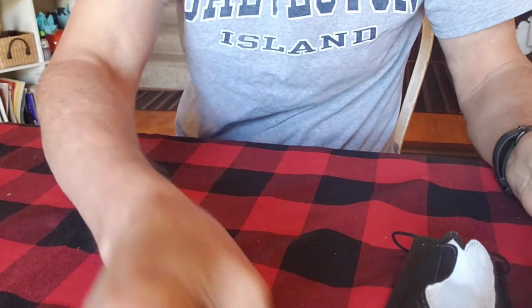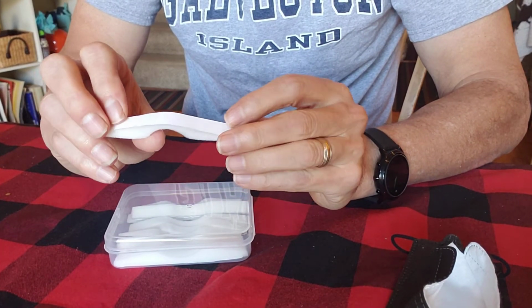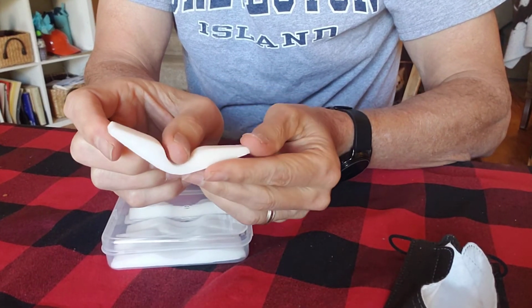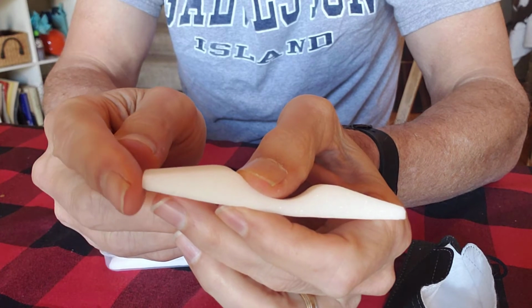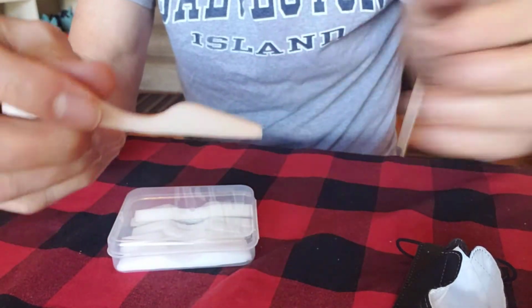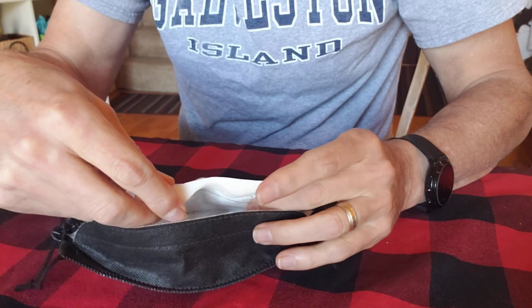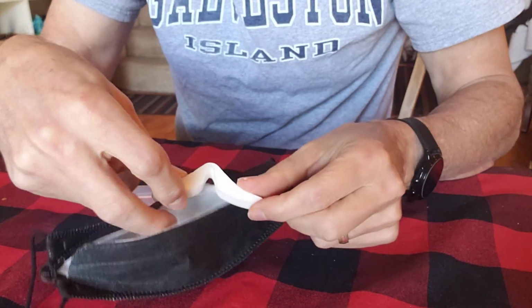I'll say one other thing: I tried first using these things from eBay or Amazon, pre-made, and I found 3 or 4 problems with those. One of them is that when you bend them around your nose, they want to bend back, and so that's going to pull the mask out. Another thing is at the end they have this ledge, which means there's going to be a gap right there, that allows air to flow. Another thing is that, compared to where my nose is, this bump ends up too close to the center compared to where I want them.